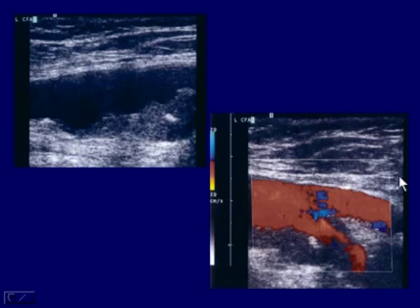Now, let's get back to the main goal of arterial testing. Here in the lower extremity, we see a relatively nice, normal common femoral artery over at this end of the image. And scanning down, what do we see? Well, we see two things. We see the vessel is pretty significantly dilated, at least about twice the luminal size as it is up here. And we can see all this debris. Now, this could be some plaque. This could be laminated thrombus. It really doesn't matter because it's there and it shouldn't be.